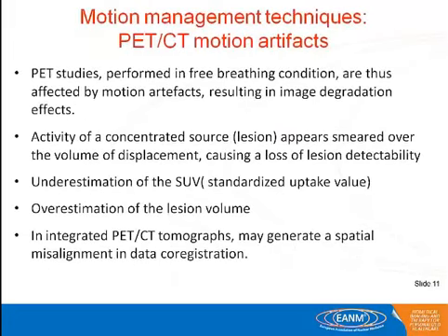Let's get back to what the problem is in motion management techniques. PET studies performed in free-breathing conditions are affected by motion artifacts, as was shown in the talk yesterday, resulting in image degradation. A constant-activity source appears blurred over the volume of the patient's motion, causing a loss of lesion detectability. There is an underestimation of SUV, an overestimation of the volume, and in integrated tomographs, a spatial misalignment in data registration.